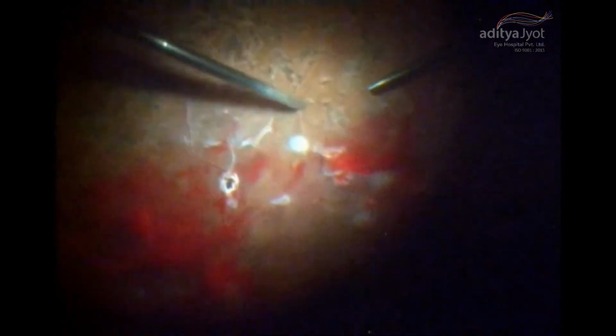And ergonomically you don't have to look into the microscope, which will again put tension on your back. So here ergonomically you can sit back and make sure that you don't have back pain using this. But the only thing is, because you have to see the monitor on a side, there's a possibility of looking a little towards one direction and operating, but it's a little better than operating on the microscope. Once I started using 3D, I routinely use it for any procedure, whether it's a vitrectomy, scleral buckling, or any buckle removal. I think everything I do under the 3D digital microscope. And the digital recording is also excellent.